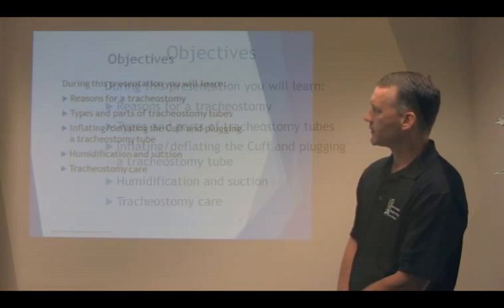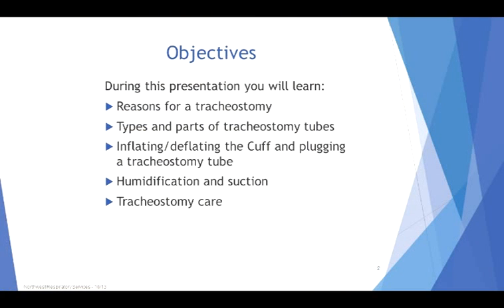Today we're going to learn about reasons for a tracheostomy, types and parts of a trach tube, inflating and deflating the cuff and plugging the tracheostomy tube, humidification and suction, and tracheostomy care.